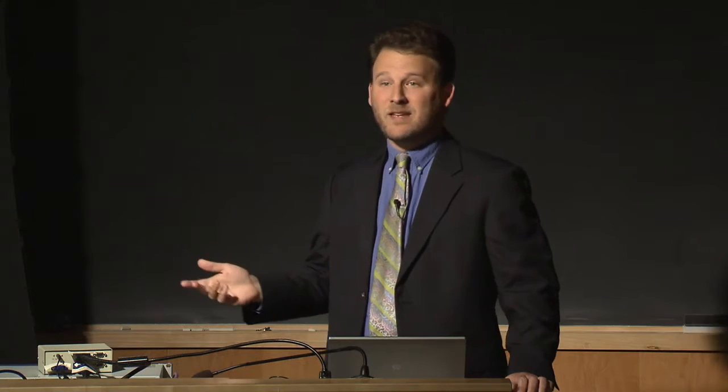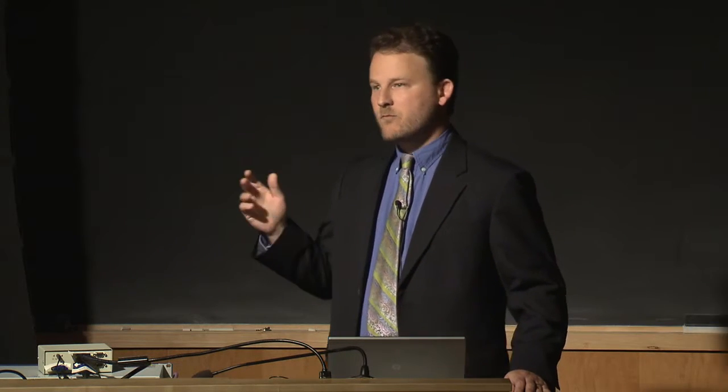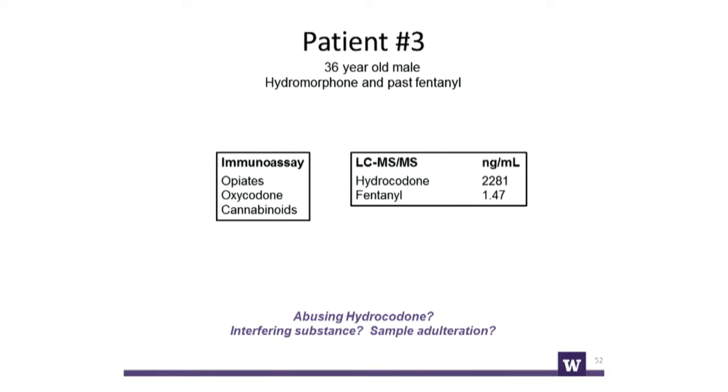One of the things that people do, because you read about it on the internet, is think, well, if you're actually not taking your drugs, maybe you're selling them on the street, but you want it to look like you are, you put a little pill in your urine. Medical testing is different from police or workplace testing, where it's not usually directly observed, and people can usually get away with dropping a little pill or a bit of their patch into their urine, swishing it around. And it will test positive, as you can see, it tested positive on the immunoassay.